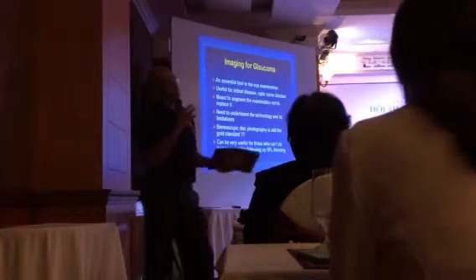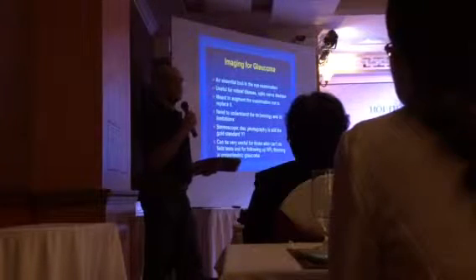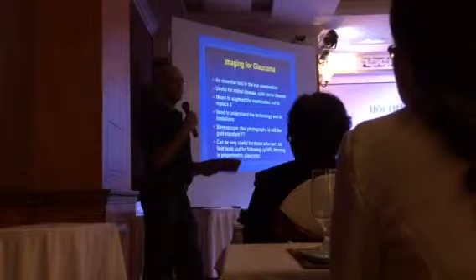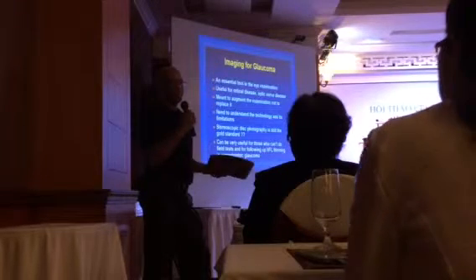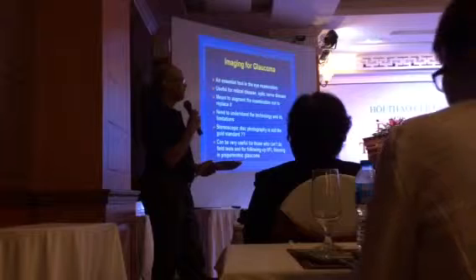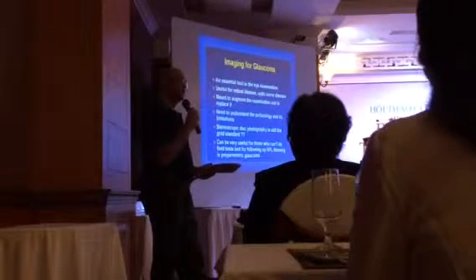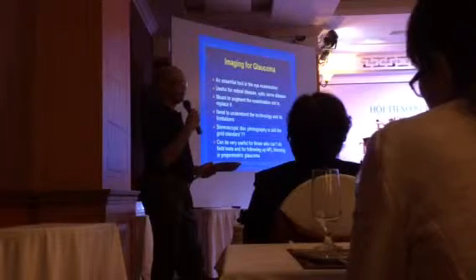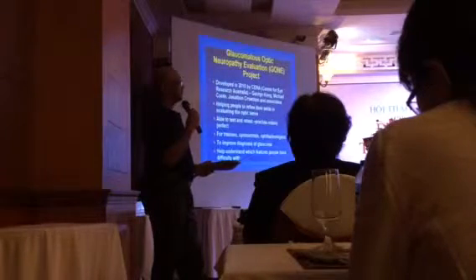Stereoscopic disc photography is not as popular these days, but still it's very useful. But understand that it's not always convenient, and it can be a little bit difficult to perform and organise. Imaging is useful for those who can't perform visual fields, and also for determining, if you have reliable imaging, looking for pre-perimetric glaucoma.